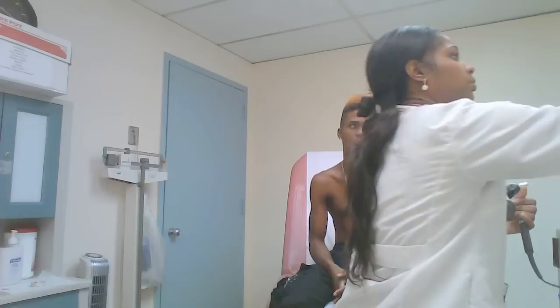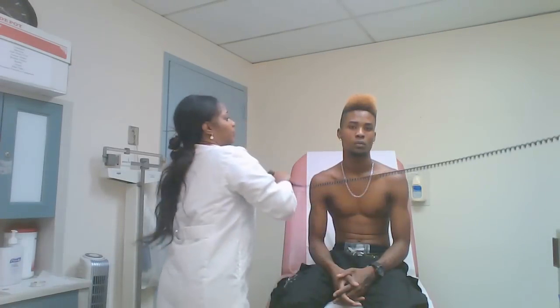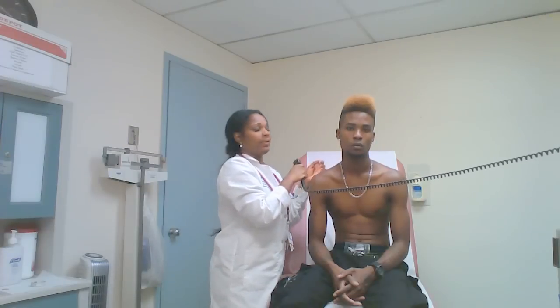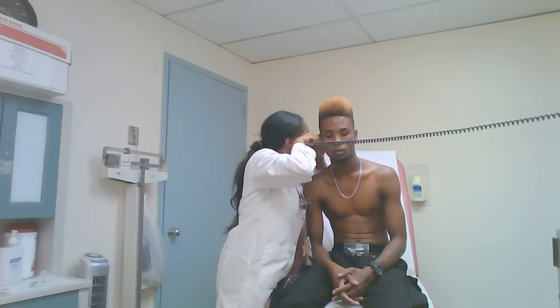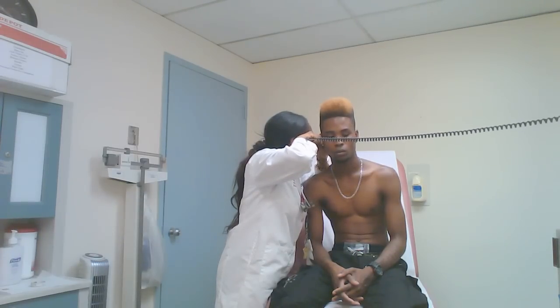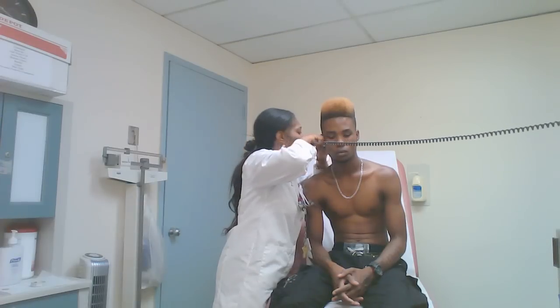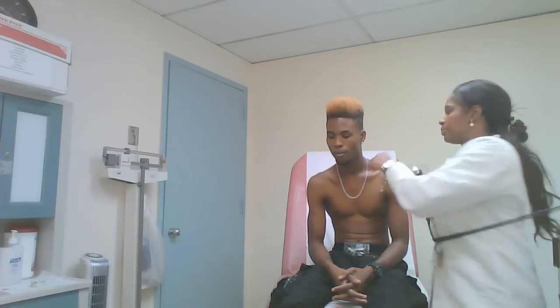Okay, gonna be assessing the tympanic membrane. Come closer, please. The tympanic membrane is pearly. It's shiny. See a little bit of cerumen. Is there any pain there? No. Okay. To the next ear.